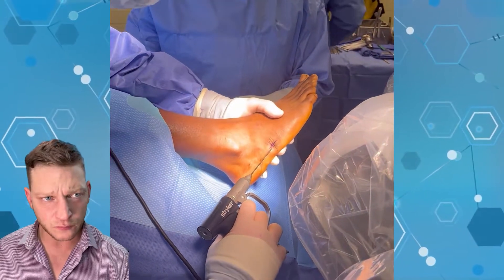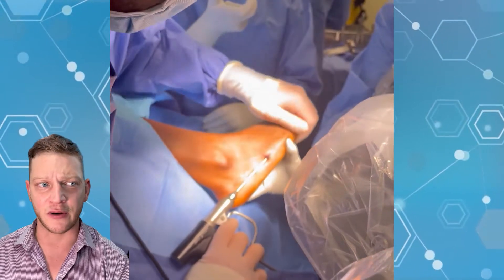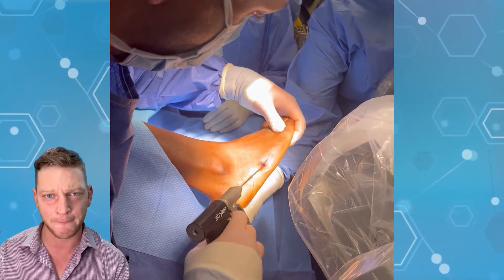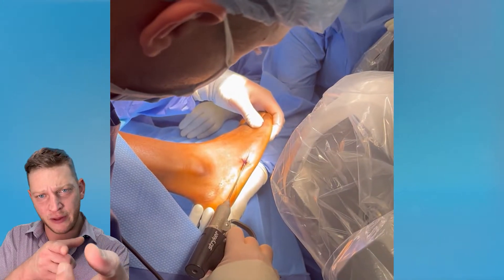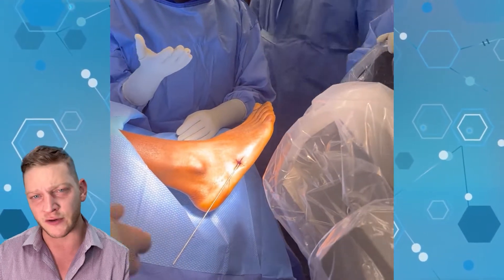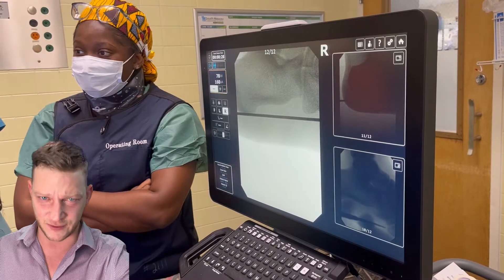You can see we're advancing the K-wire. We're optimistic we're going in the right direction, and once we cross that fracture line we're doing great. I'm trying to aim it down the shaft distally — I pinch the tip of where I'm aiming and with proprioception I can do it without looking; I can always put my finger right in the spot no matter what direction I'm in. It's easier said than done, just trust me on that.